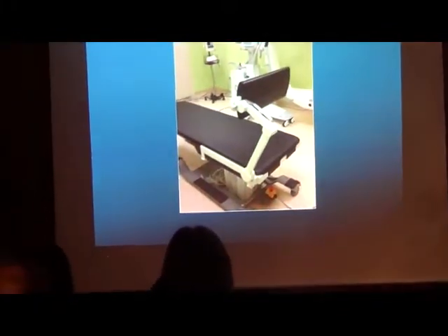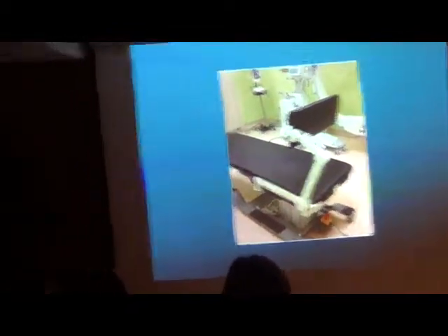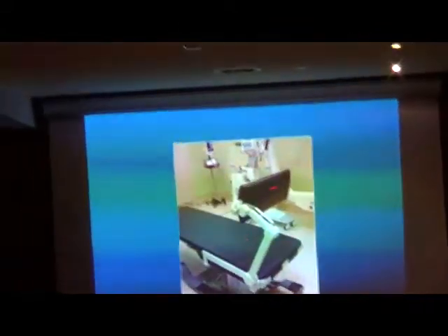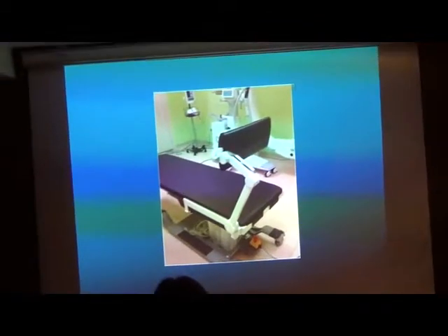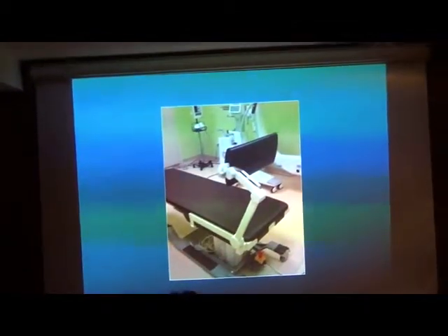Okay, this is the device I use for doing procedures in the sitting position. It's called Fluorarm. It has a frame that attaches to the table. It has an arm. It's actually flexible. It can be flexible to any body size and form. And this is a carbon fiber covered with some foam for comfort. Carbon fiber is radiolucent, so it doesn't obstruct the view.